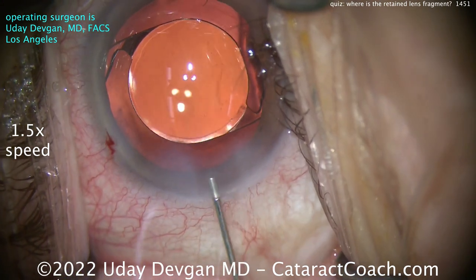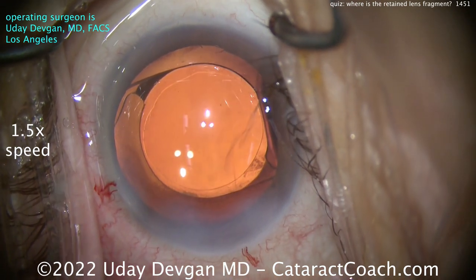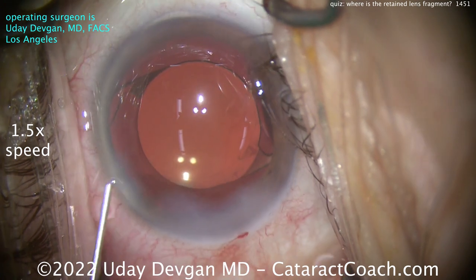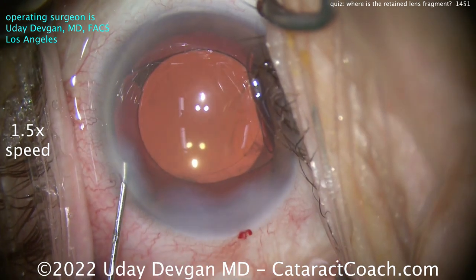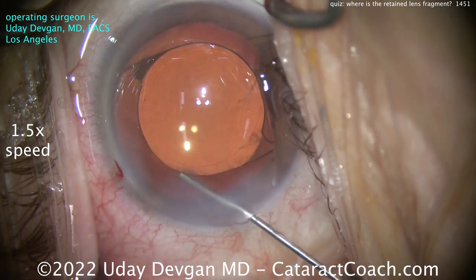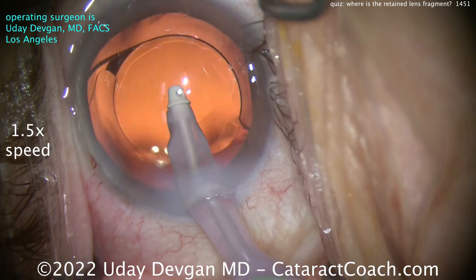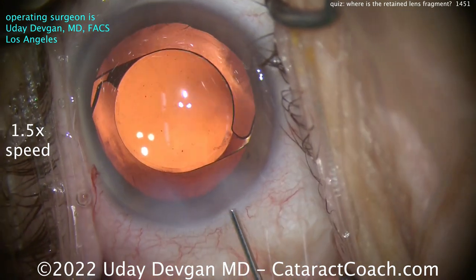Let's seal the incision — wait for it. Now let's put in a little more triamcinolone, throw that around, and get some moxifloxacin inside the eye. Here's the moxifloxacin going in — watch carefully. Looks pretty good, I'll take it. But wait — what's this right here? Hey, surprise: another piece!